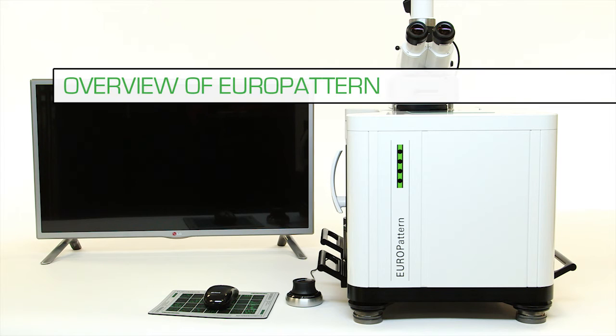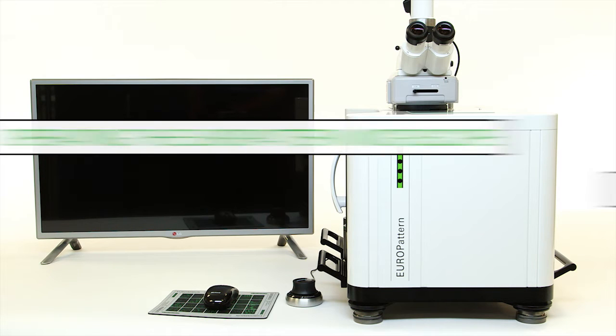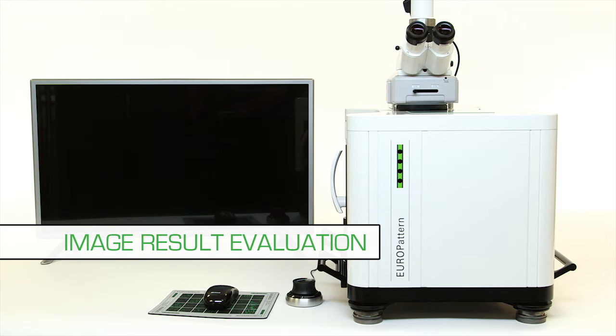This demonstration will consist of four parts: an overview of the Europatterns system, operating the Europatterns microscope, image acquisition and image result evaluation.